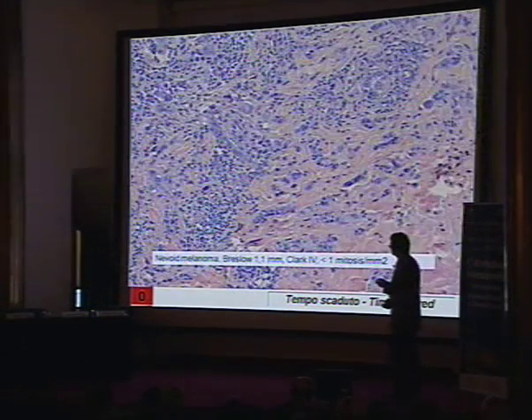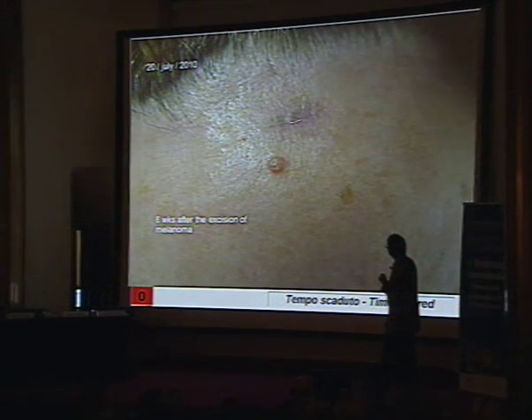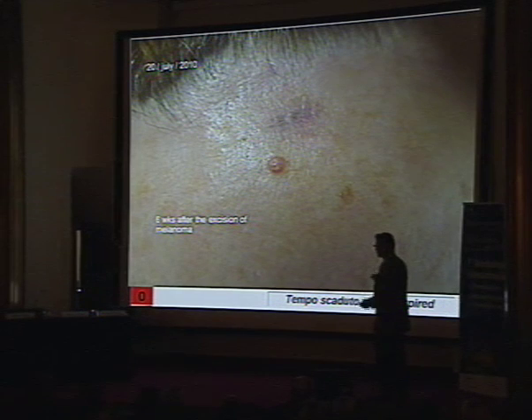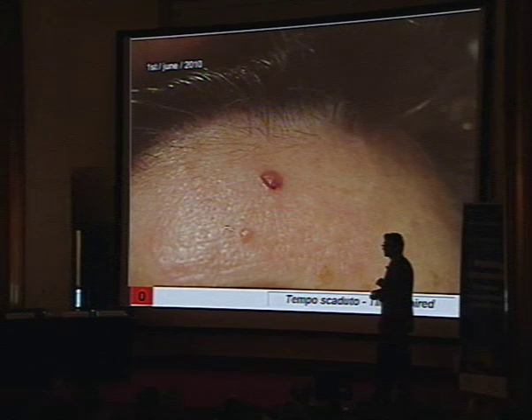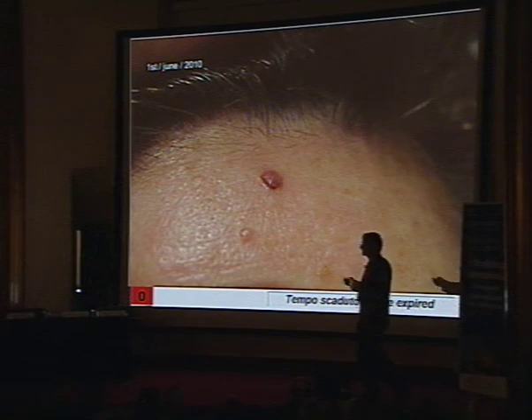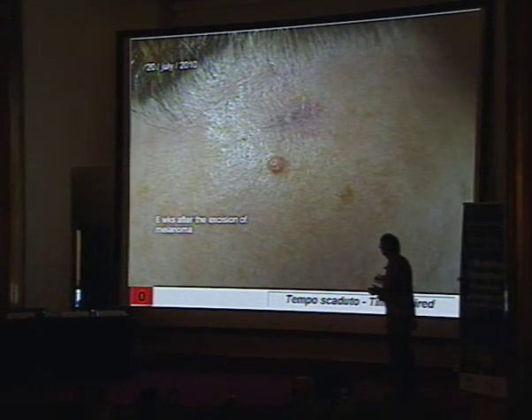And we could do the correlation. But what I want to share with you is that this lady, of course, had this lesion removed, but looking here, in 6 weeks, we had this other nodular lesion. And this was a lesion that was, of course, for us, absolutely banal at this time. But this lesion was growing for 6 weeks, and in the control visit after the excision of the tumor, and waiting for the wide excision, we could see this.